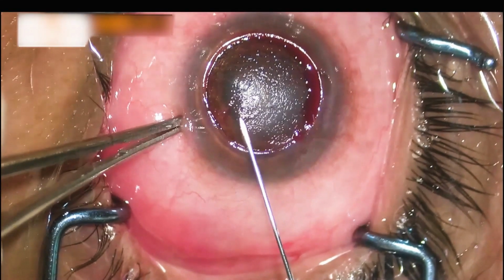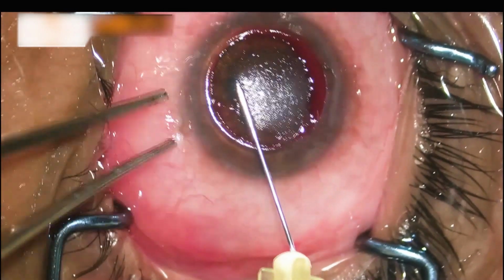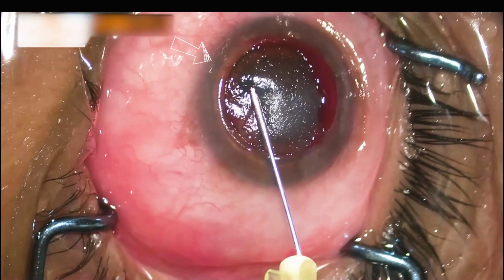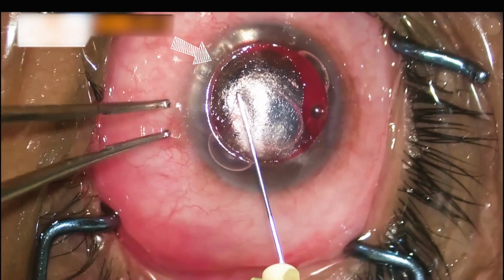Air injection in deep stroma is done using a 30 gauge needle attached to a 2 cc syringe with its bevel down. One can see the formation of a type 2 bubble starting in the periphery and moving towards the center.